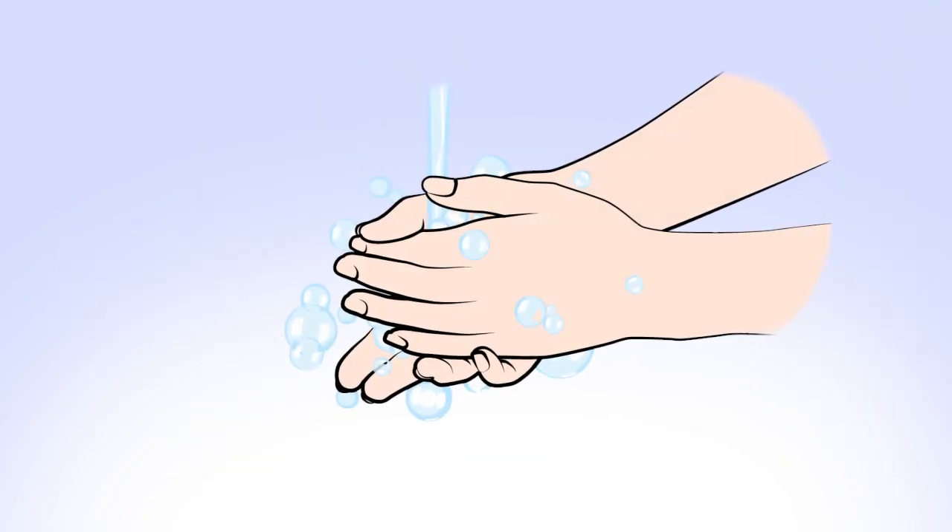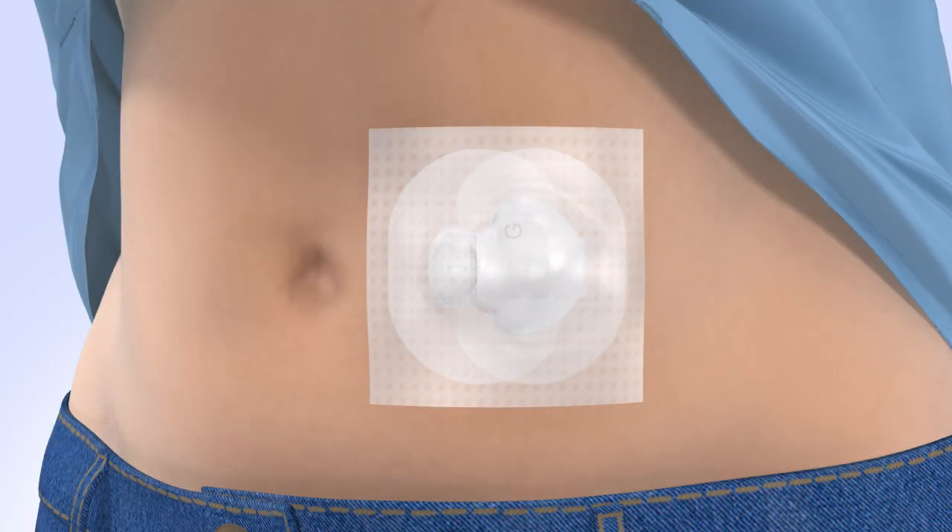Wash your hands before you begin. Before you insert a new sensor, you will need to remove your old sensor.